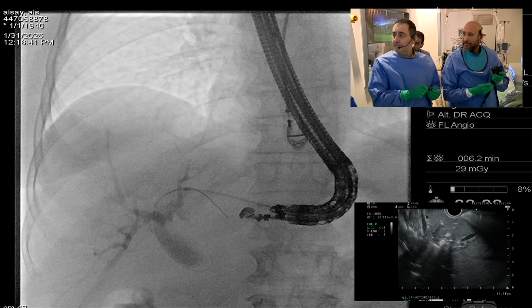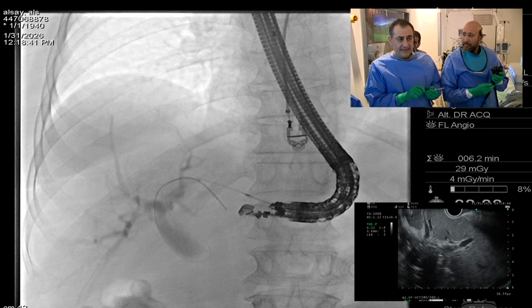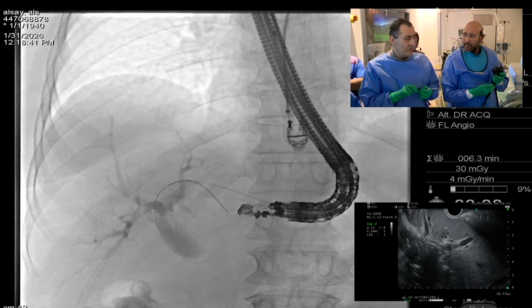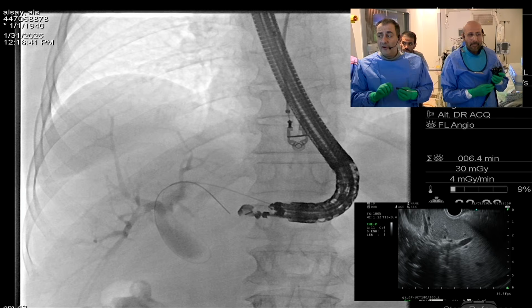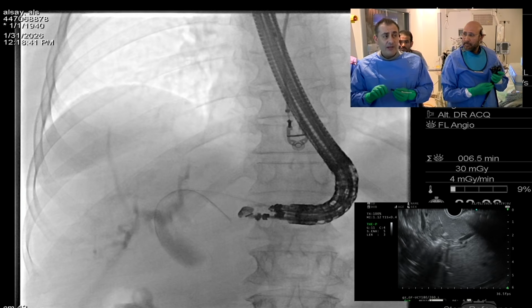Okay. That is a gold stent. Yes, exactly. We're going to flush it, please. Flush it. Okay. Here we go. Alrighty. So you see how I'm trying to be safe. I buckled the wire on itself, so that like this we have leverage and we don't lose access.